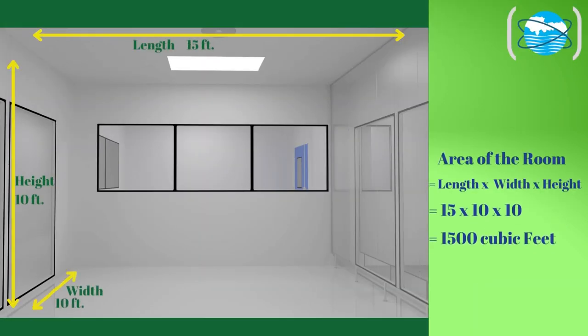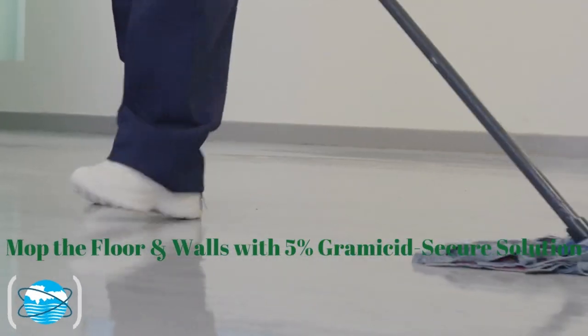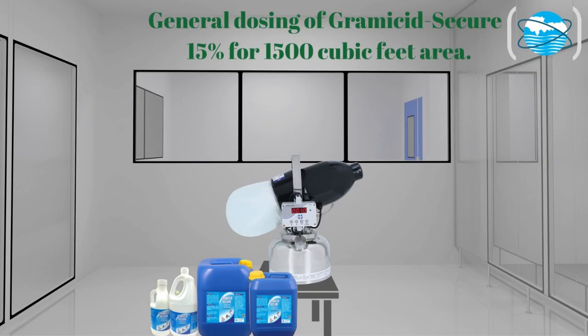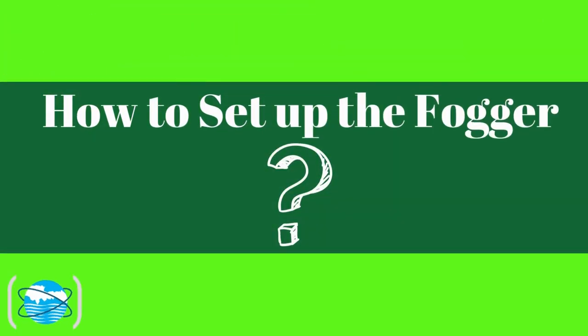Cover electronic devices and machinery with plastic sheets. Always switch off the AC or AHU units. Measure the area of the room, considering its length, width, and height. For complete disinfection, first mop the floor and walls with 5% Gramacid Secure solution. For fumigation, the general dosing of Gramacid Secure is 15% for 1,500 cubic feet area.